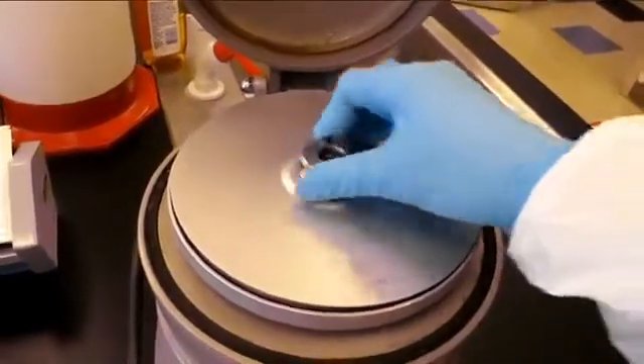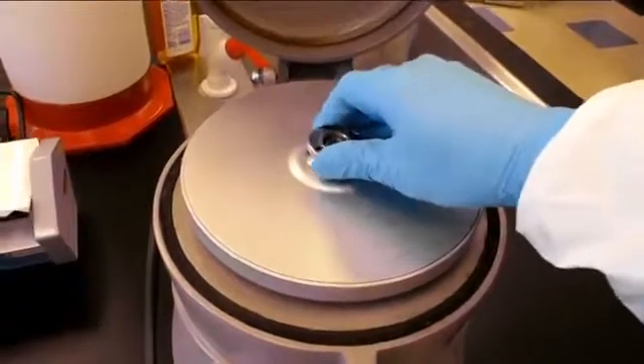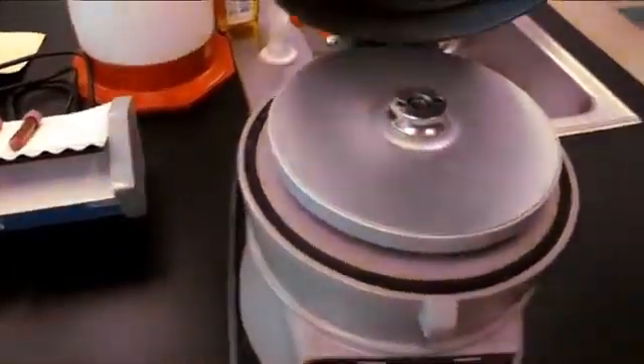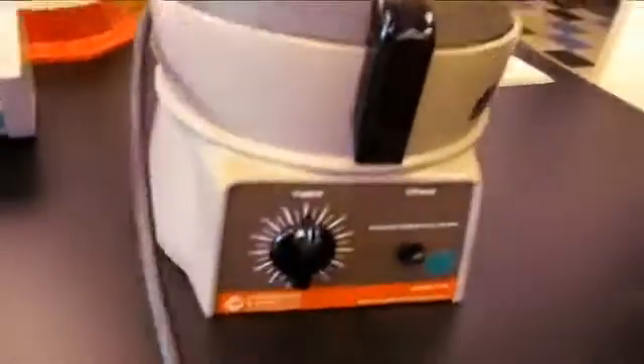Place the cover back on and close the lid. Centrifuge the sample for at least 4 minutes. This is simply done by turning the knob slightly past the number 4.